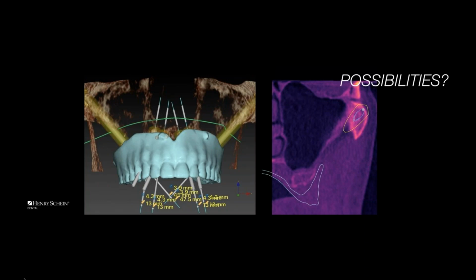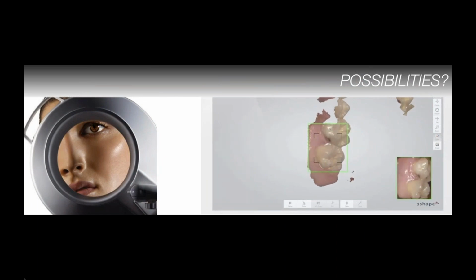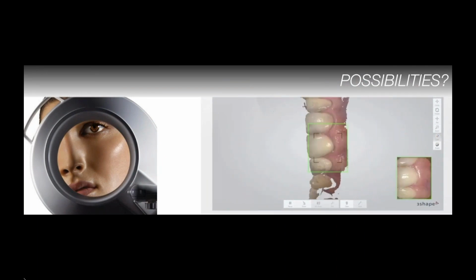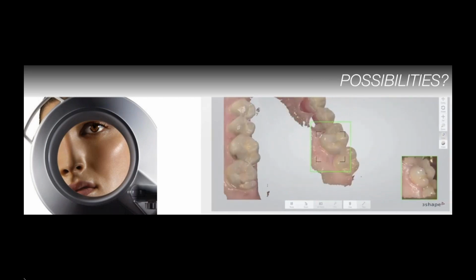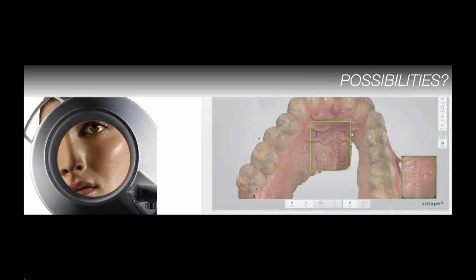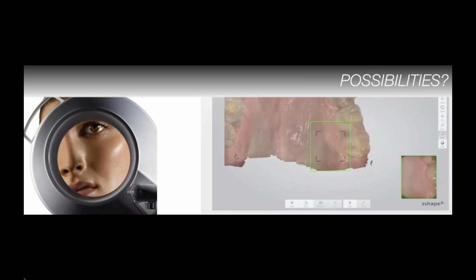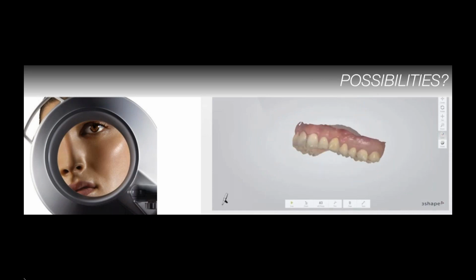And we have this for CBCT, we have this for intraoral scanning, where is it more than just replacing the alginate? And the answer to me today is absolutely, because now we can use that data. We can go in our softwares with intraoral impressioning or intraoral scanning and get more utility out of that information than just replacing an alginate or a PVS material.